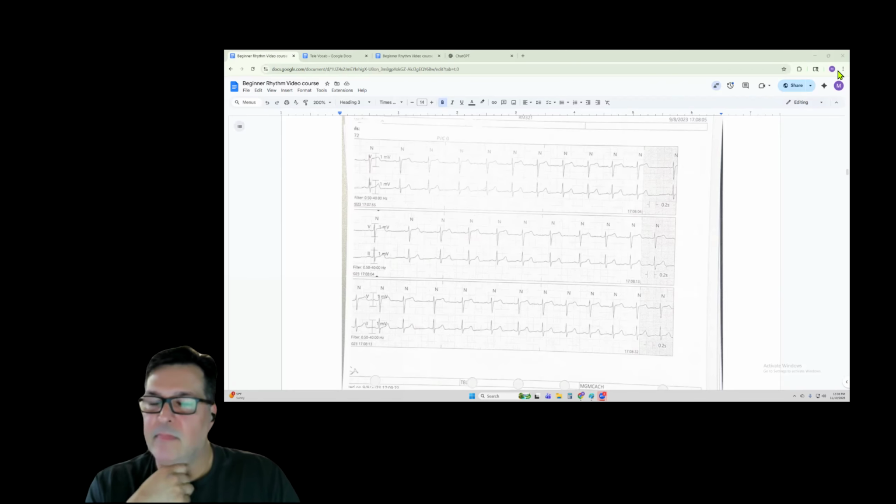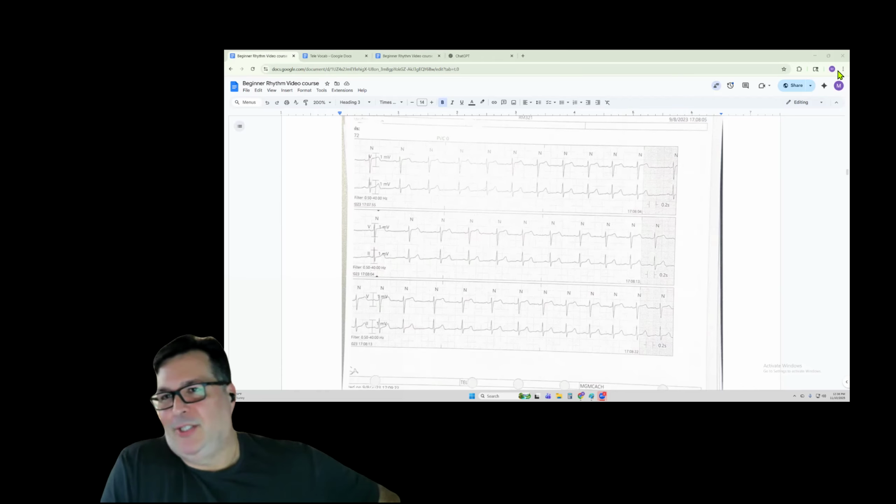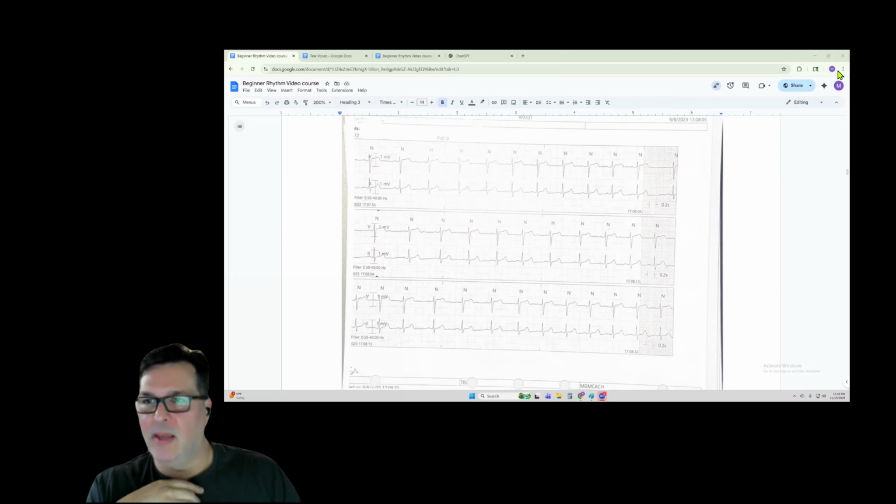Well, is sinus arrhythmia normal then? Yeah. I see what you're saying. Arrhythmia sounds terrible, it sounds bad, but it's just a difference or an irregularity, and it doesn't mean it's bad. So you have sinus rhythm, which is the regular version, and sinus arrhythmia is the irregular version. The irregular version usually has a pattern.